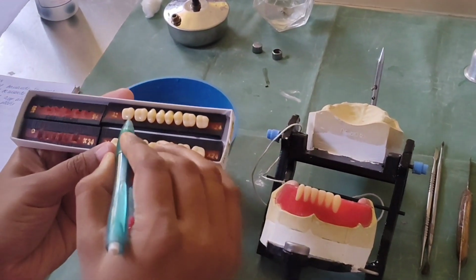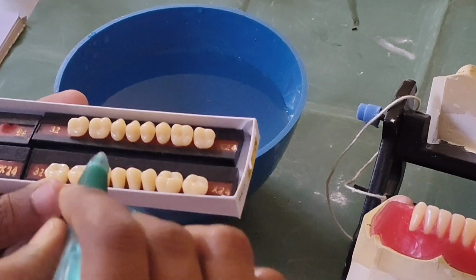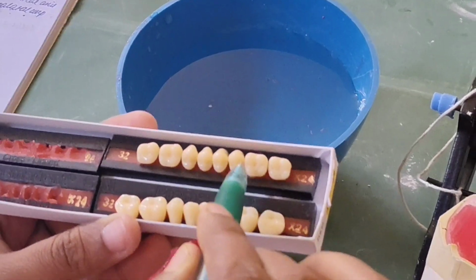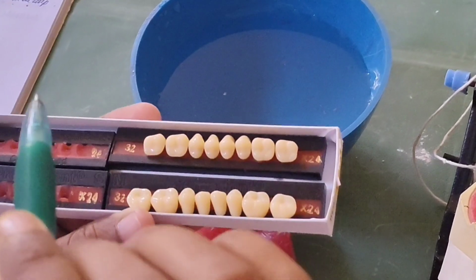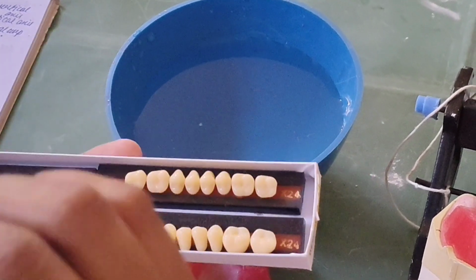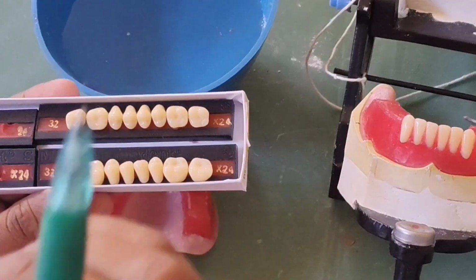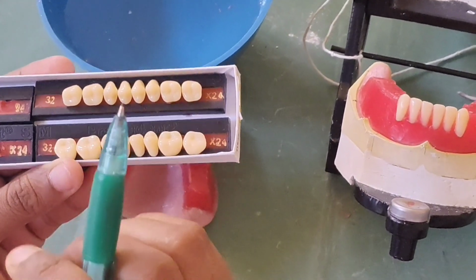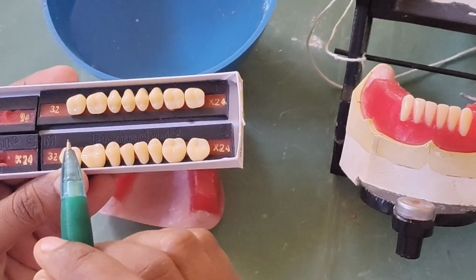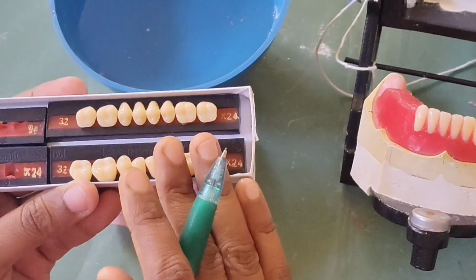Apart from that, for all these posterior teeth, if you are confused about which is maxilla and mandible, you have to see: maxillary premolar cusps are sharp and prominent, and mandibular premolar cusps are rounded and small. Maxillary molars are small, mandibular molars are big. Maxillary first molar will have a fifth cusp. Mandibular molar will not have that. Okay, you have to be careful.